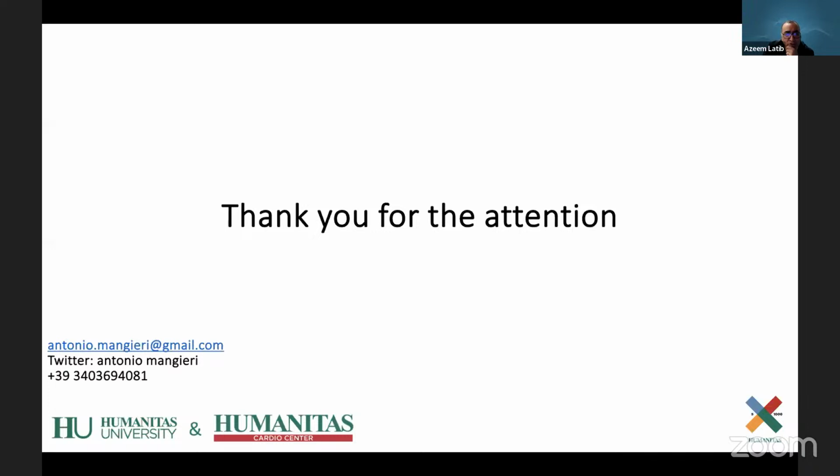There was one question here: what do you recommend as the minimal setup of balloons in countries or areas where there are lots of cost constraints? So I would say, and let's see what you say, Antonio, you need to have non-compliant balloons. I don't use semi-compliant balloons anymore. I only pre-dilate with non-compliant balloons. If I had to choose between Wolverine and a scoring balloon, I would choose Wolverine. If I had to choose one, and I think you need at least those two.